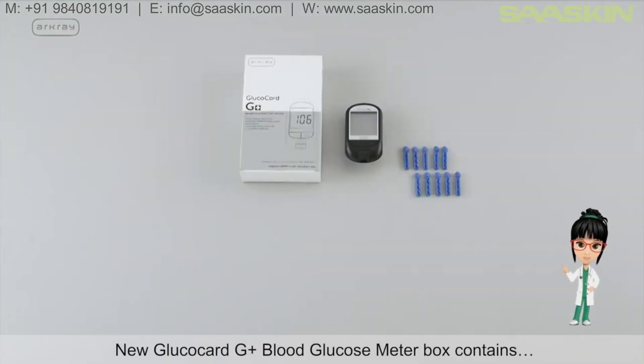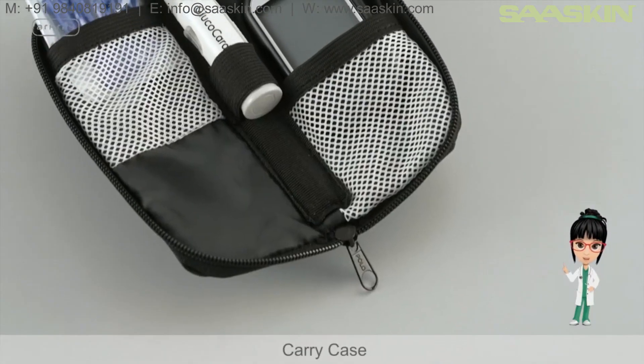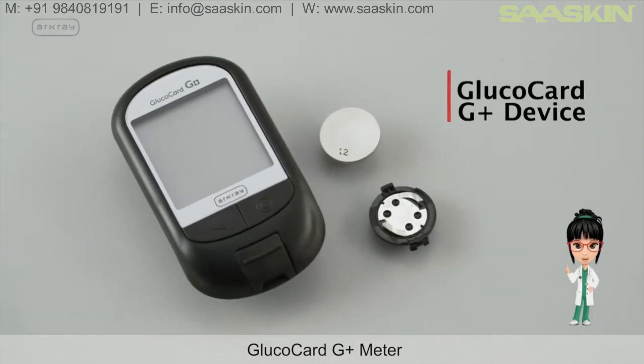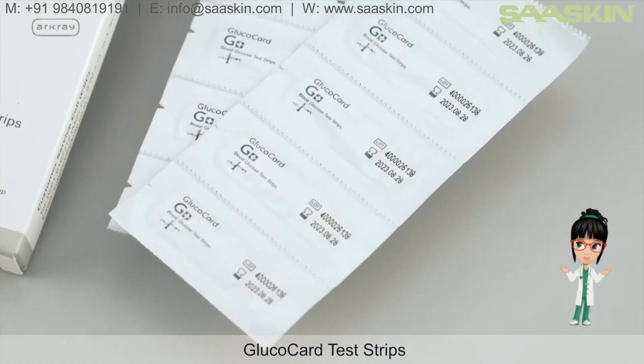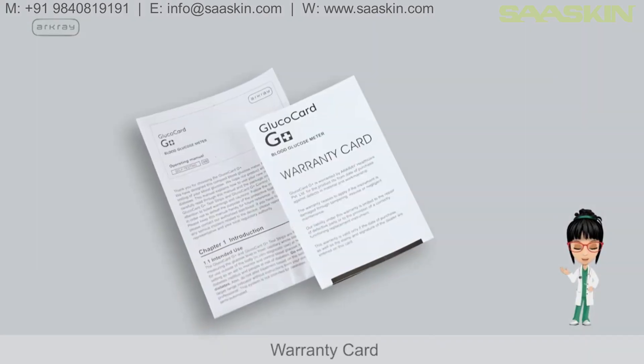The new Glucocard G Plus Blood Glucose Meter box contains an attractive carry case, the Arkray Glucocard G Plus Meter, Glucocard Test Strips, a lancing device, a lancet, and a warranty card.